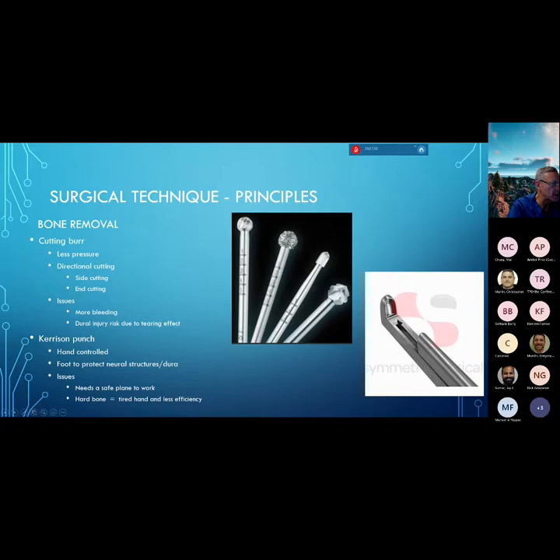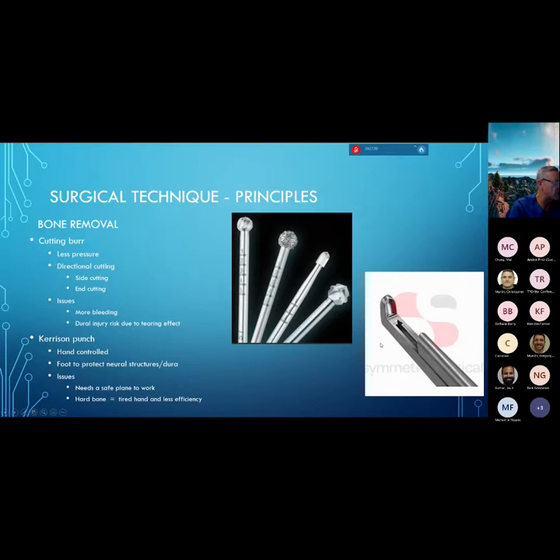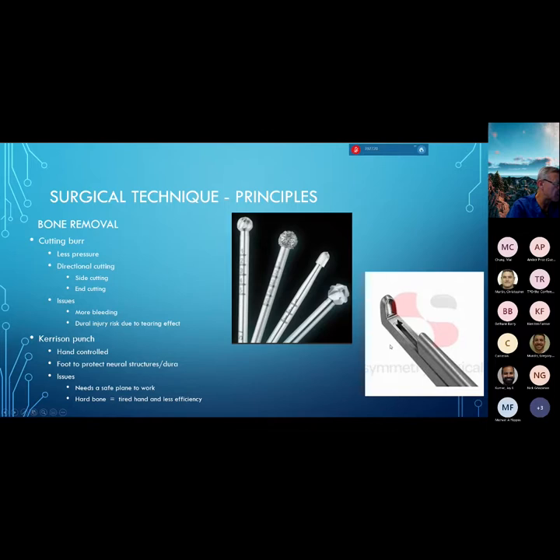These are the other tips available: a cutting burr, a more coarse diamond, the precision tip, an end-cutting and side-cutting version, and a really aggressive cutting burr. Then you have the Kerrison punch to remove bone in conjunction with the burr. Once I've done the majority of burring, I'll use the Kerrison to finish my laminotomy or laminectomy. The foot of the Kerrison is designed to protect the underlying neural or vascular structures, but you've got to create a safe plane for it. You can't just push it into the spinal canal — if the dura is adhesed to the underlying bone or ligament and you go in with the Kerrison punch, you will inadvertently cut a hole in the dura. I use an angled curette or Woodson to separate the plane before using the punch, creating a safe working plane.